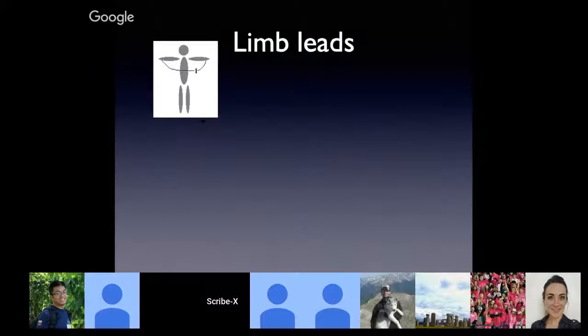So the limb leads attach to the limbs and record voltage changes in a vertical orientation, or a plane oriented along the limbs, if that makes sense. So lead 1 attaches on the right arm and goes to the left arm and receives signals basically right to left in most cases.